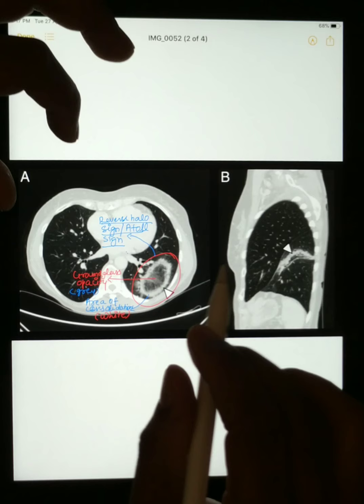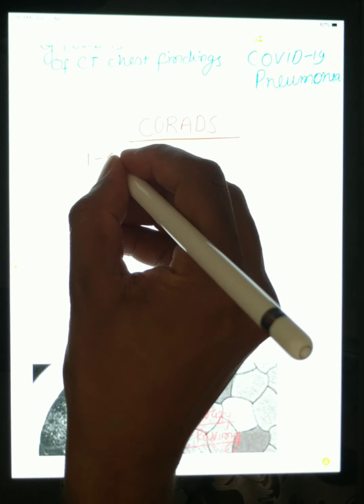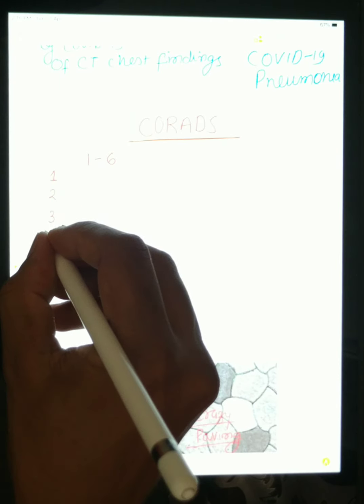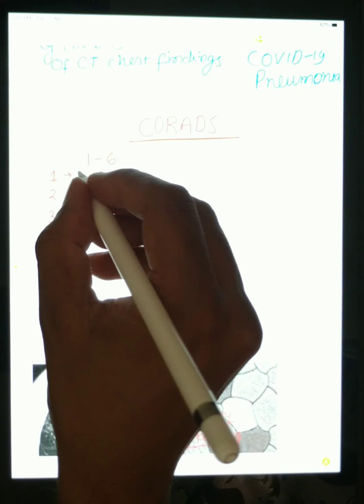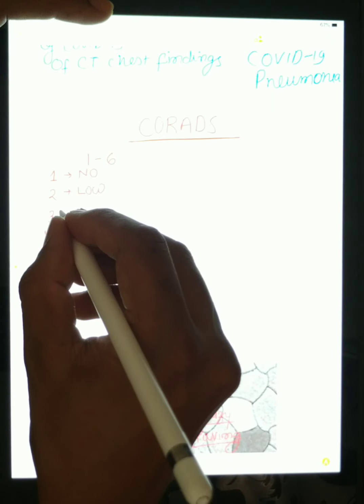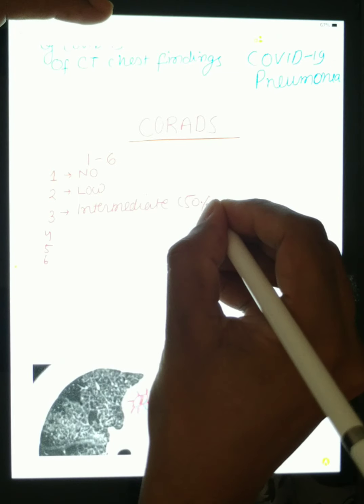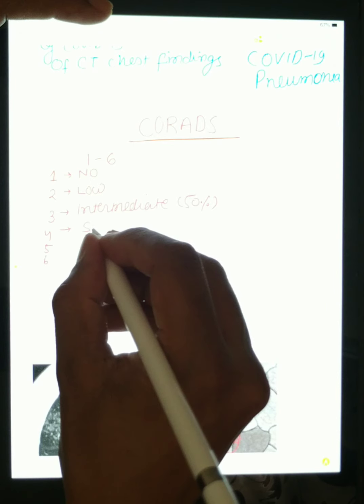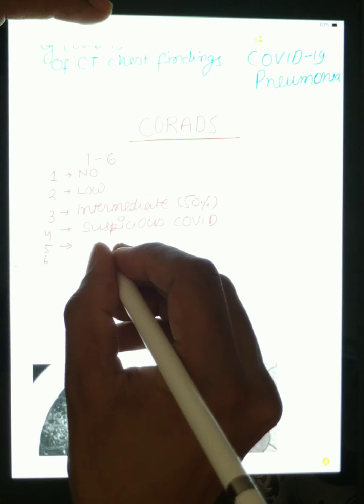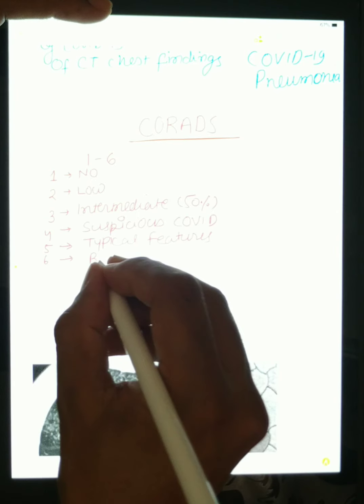So now we will go back to CORADS scoring. In CORADS scoring, a number is given from 1 to 6. If the number is 1, there are no chances of COVID-19 pneumonia. Number 2 means low chances of COVID-19 pneumonia. Number 3 is intermediate — 50% chances of COVID-19 pneumonia. Number 4 is suspicious of COVID. Number 5 means typical features of COVID-19 pneumonia. And number 6 is RT-PCR positive COVID-19 pneumonia.